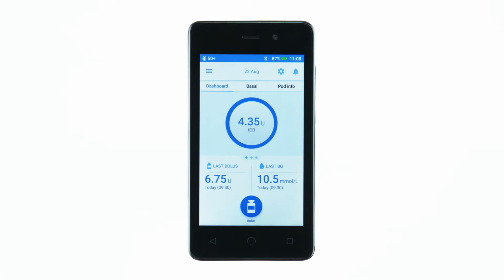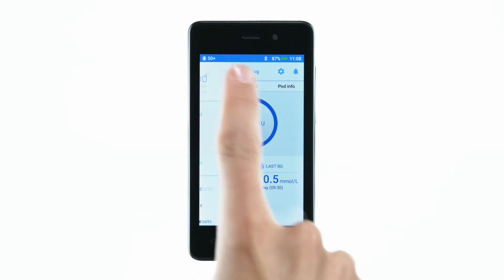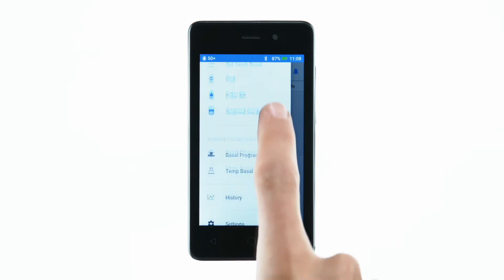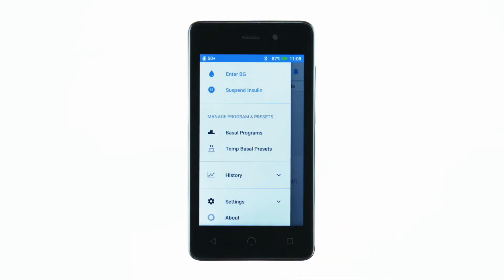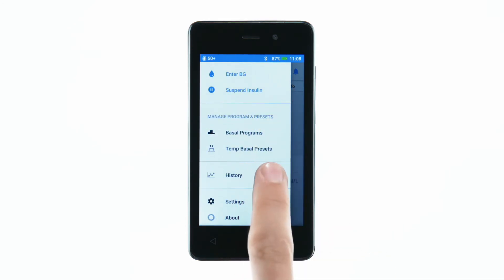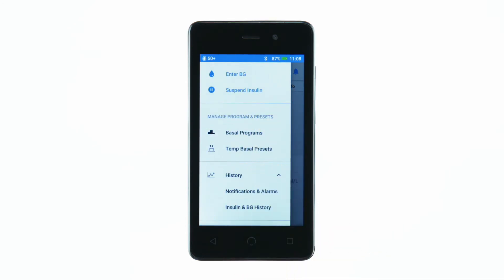To view insulin and BG history, tap the menu icon, then History, then Insulin and BG History.